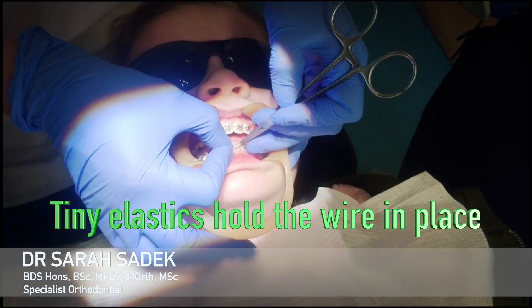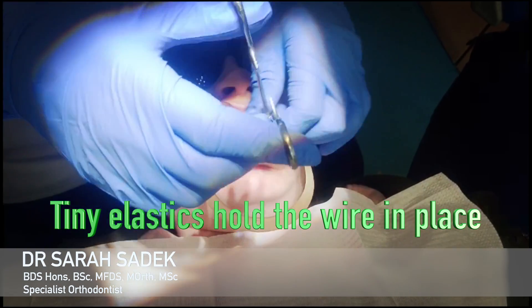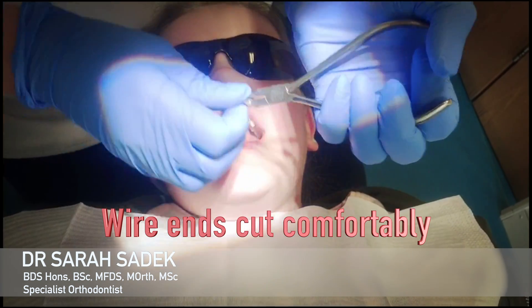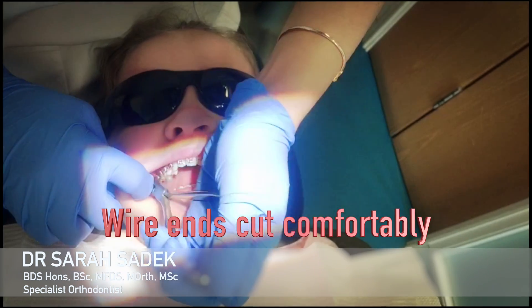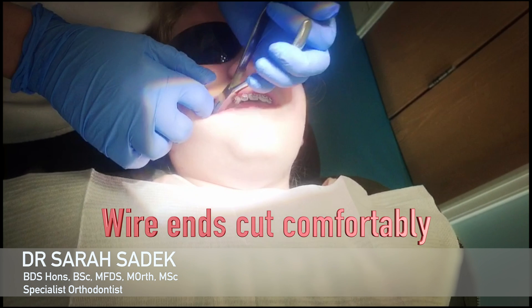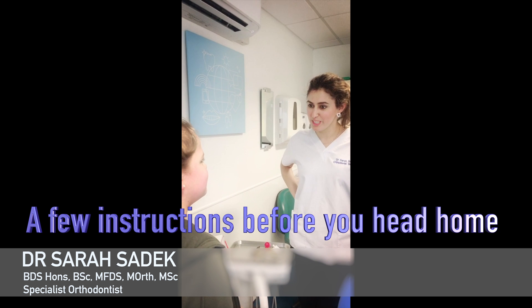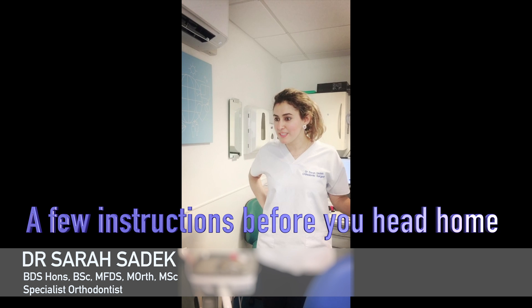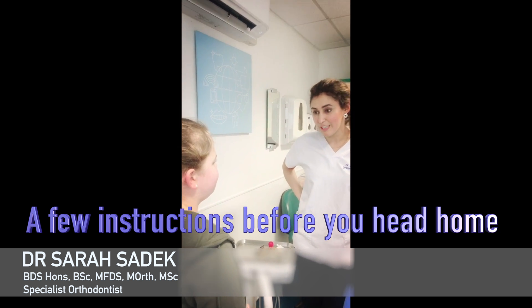If you do want your brace to stand out and look quite funky, make sure you pick a nice colour. The ends of the wire are then carefully cut so that they don't dig into your cheeks. And there you have it — the brace is fitted. We go through a few dos and don'ts to help you look after your brace. Good luck during your brace journey!